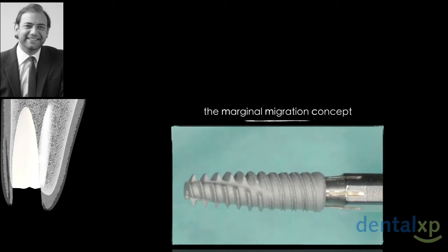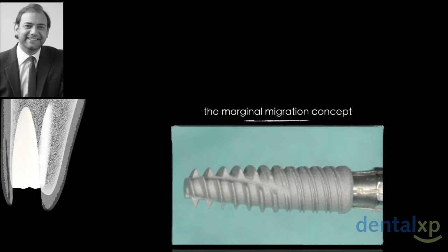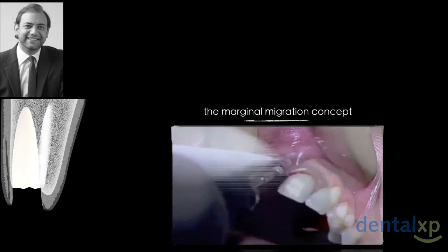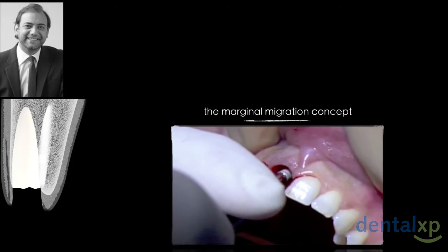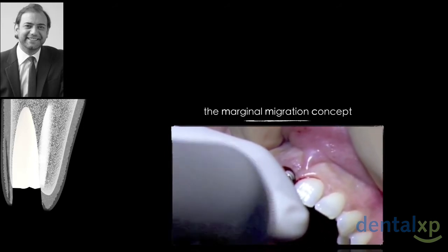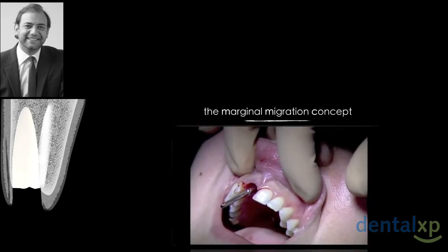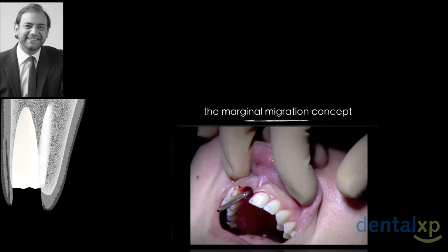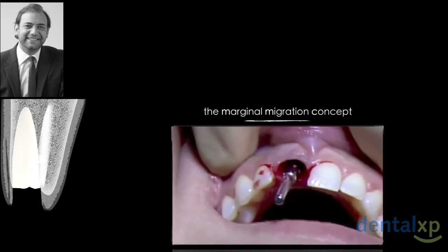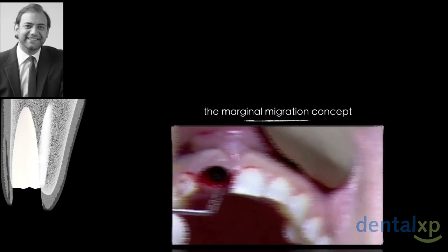This is my in-cone implant with an aggressive apical part, which I need in order to stabilize. And again, I will use hand instruments. This is my left index protecting the direction I'm placing my implant. I like hand instruments. And this is the final position of the implant. We will stop, check the depth, the inclination, everything.